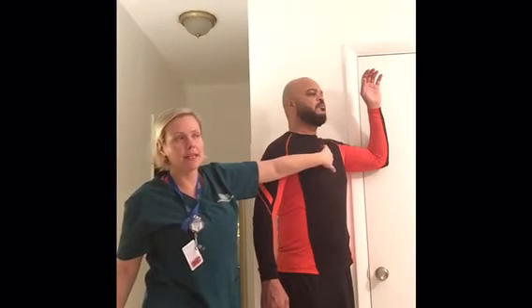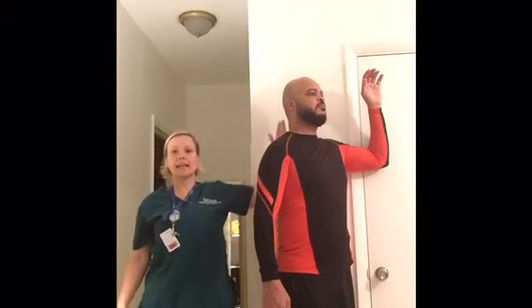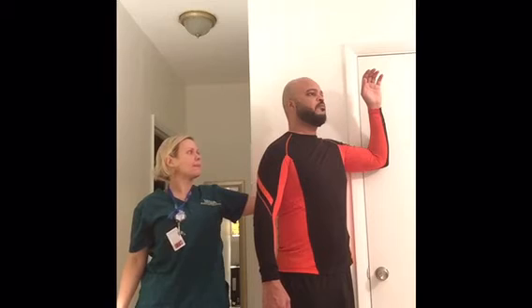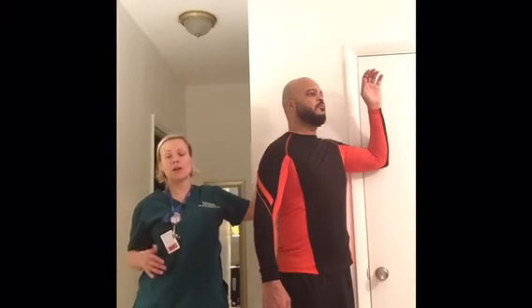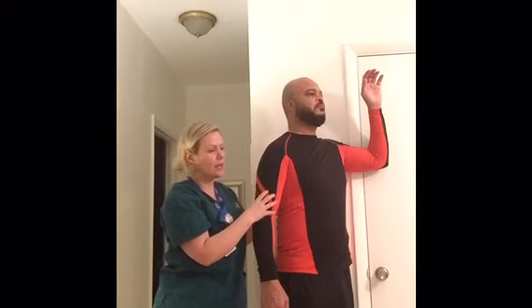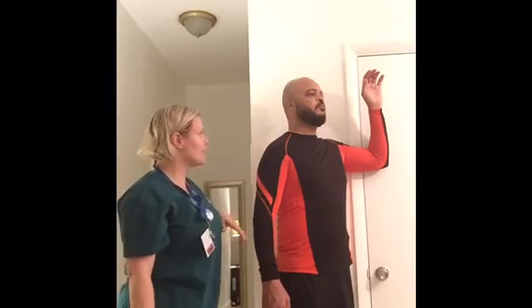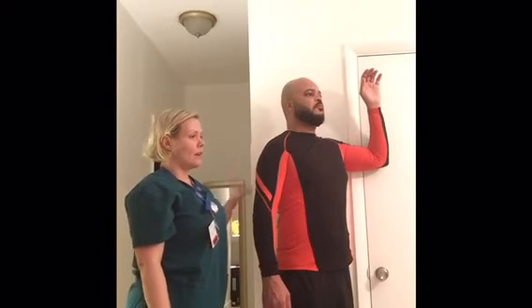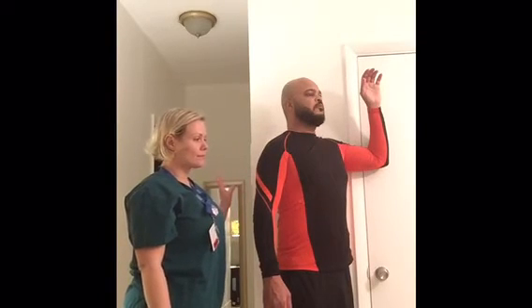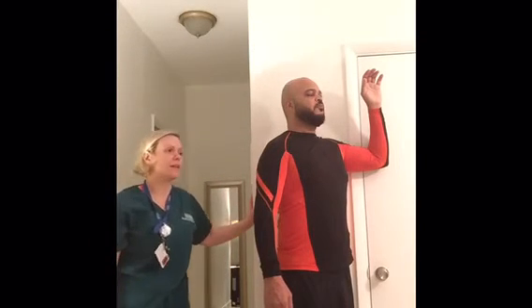In this case, you need to make sure that the central ray is correct. It will be a little bit odd when you have the light field, but it should be accurate. And so we're going to ask our patient to please breathe in, and then hold it, exposed. You can breathe out and relax.